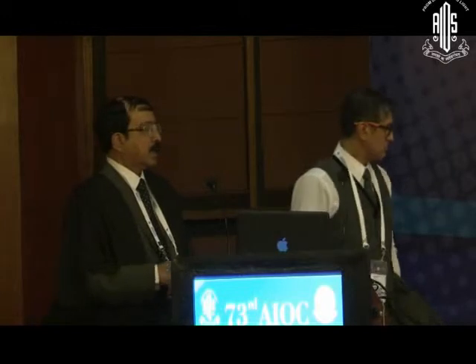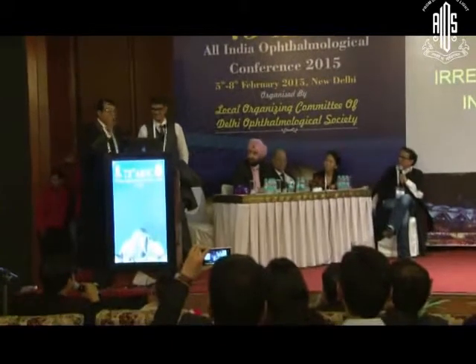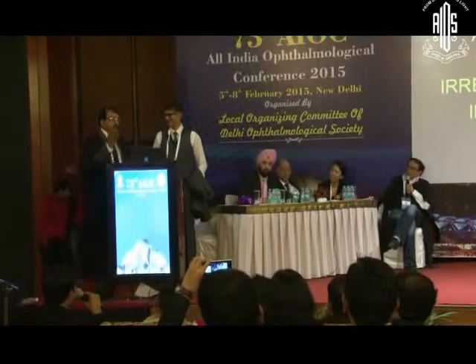Do you remember, Mahipal? What about your opinion, sir? You are not talking at all. What are you missing? Our defendant, sir, already said the way to do it: one IOL, wait for stability, put a second IOL in the sulcus. A piggyback IOL. Just wait, let us hear the jury member.